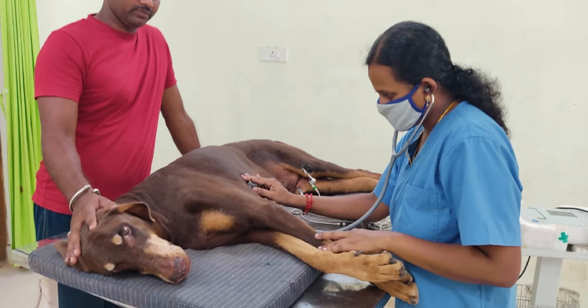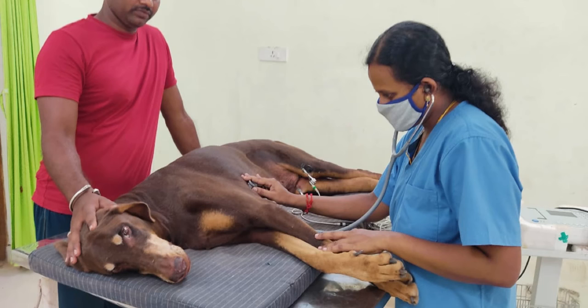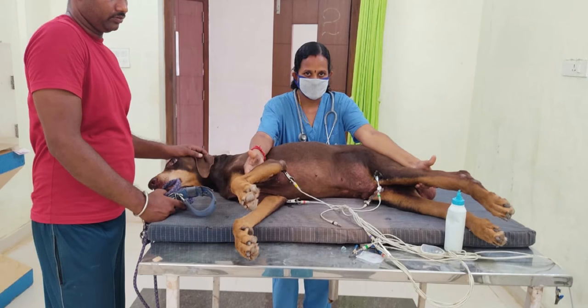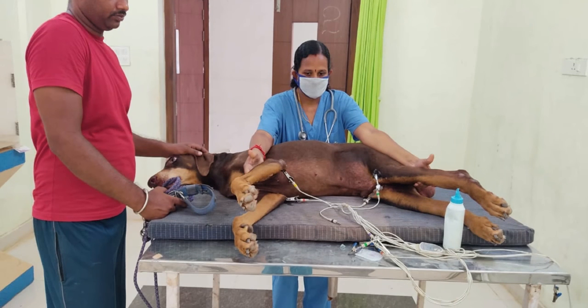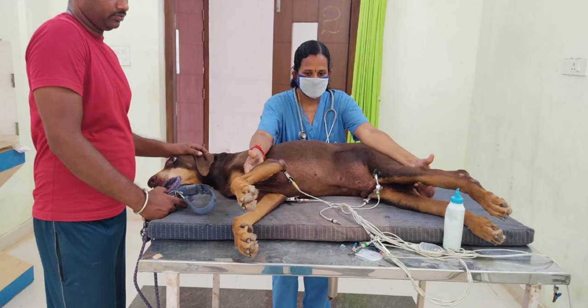In canine patients, the patient should be placed in right lateral recumbency to record a diagnostic ECG. This position is standard for ECG recording because standardized measurements are all obtained in this position. However, placing patients in right lateral recumbency is sometimes unrealistic, and in these cases the ECG is still valuable for assessing heart rate and rhythm, but is not a true diagnostic ECG.